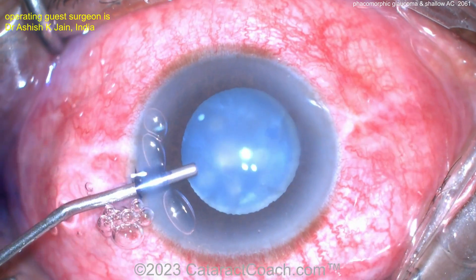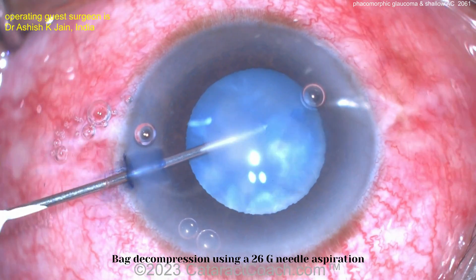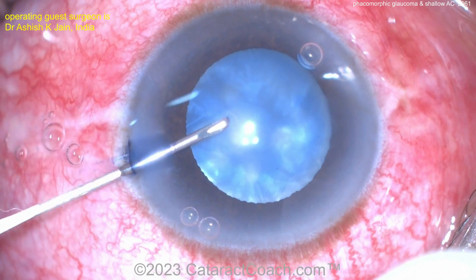There's the TriPan Blue Dye. Putting some viscoelastic in there, trying to deepen it up a little bit. Needle decompression — 26-gauge needle going beveled down, aspirating, trying to get some of that liquefied lens material out. That'll give you a lot more room.